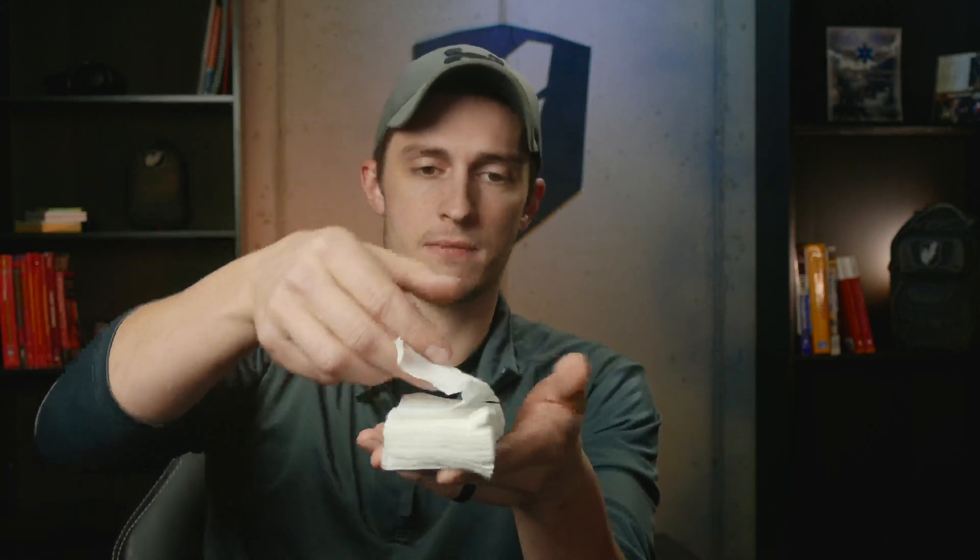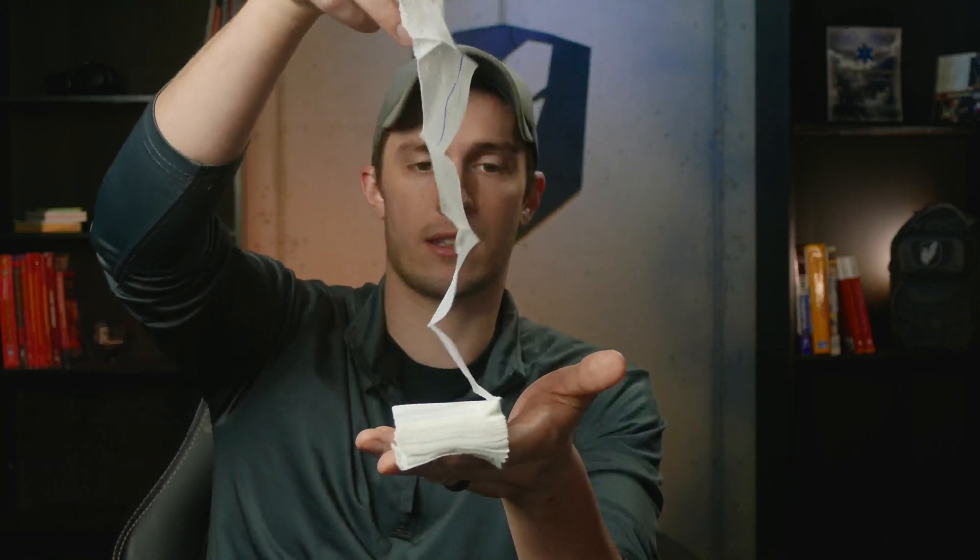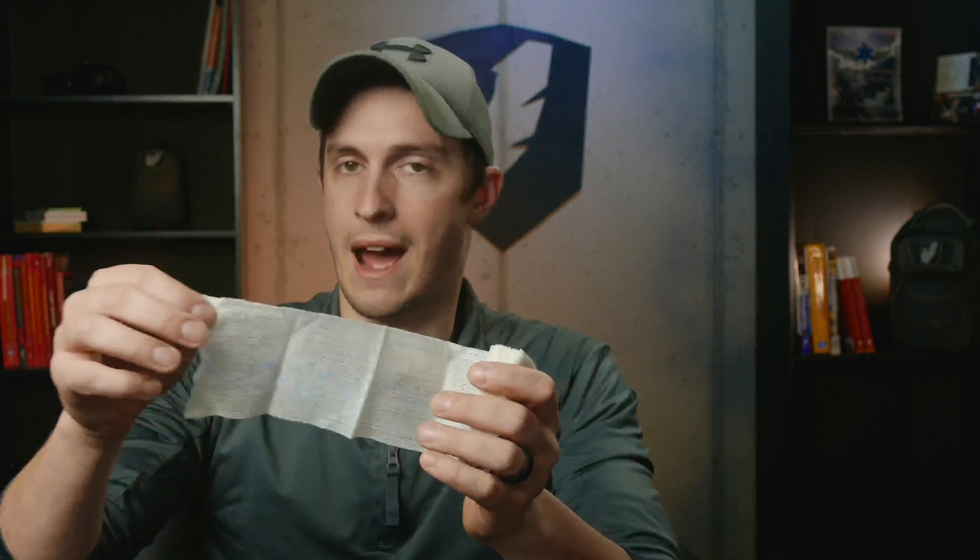This is also Z-folded in here. As you can see, it's folded back on itself. This allows you to hold it in one hand, pull it out, and pack a wound without having to set it down and without a roll of gauze coming unrolled in the dirt. So it's a lot easier to manage when it's Z-folded like this.